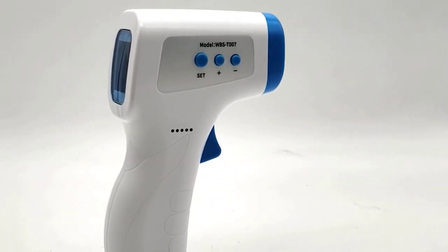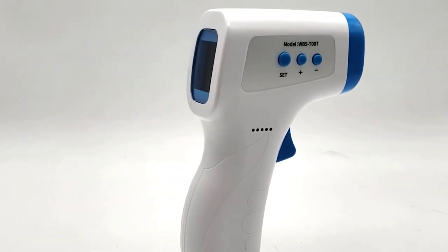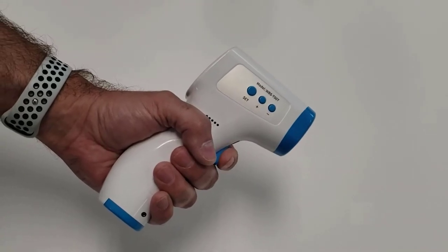Now you are ready to begin a temperature reading. To begin a temperature reading, press the start button.